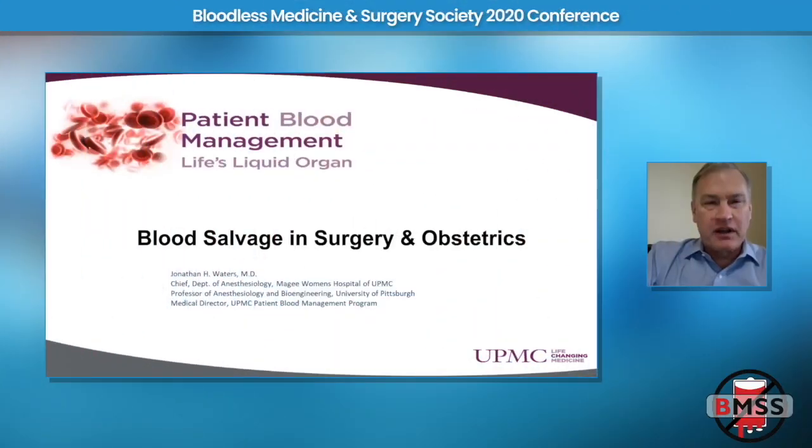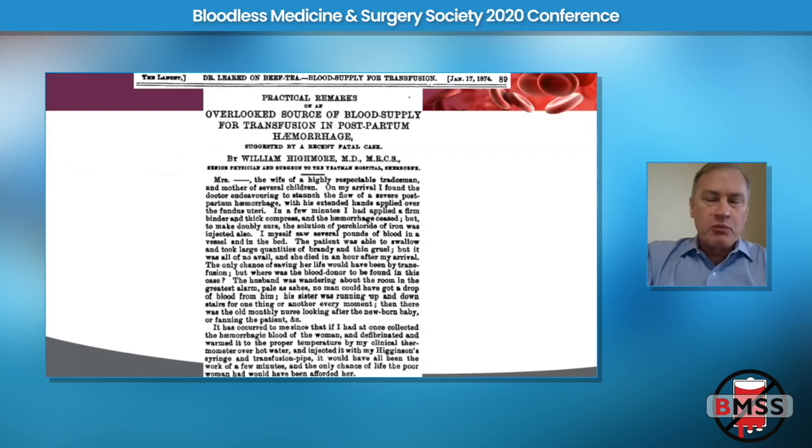Nat asked me to talk about blood salvage and surgery in obstetrics, which is a topic that's near and dear to my heart. I just wanted to start off with a little historical perspective on this particular topic, which was the origin of autotransfusion or cell salvage, blood salvage, whatever you want to call it. Autotransfusion is probably a more precise term.